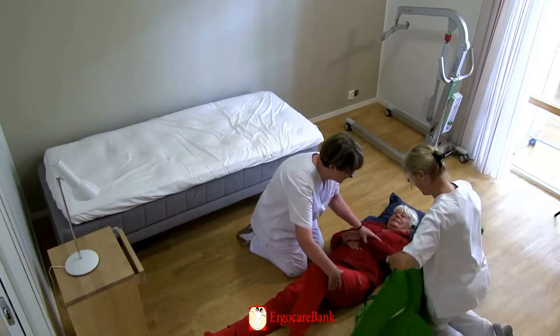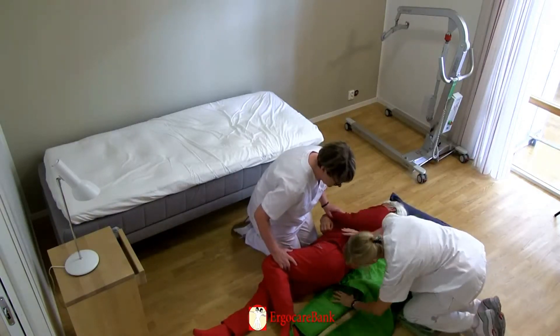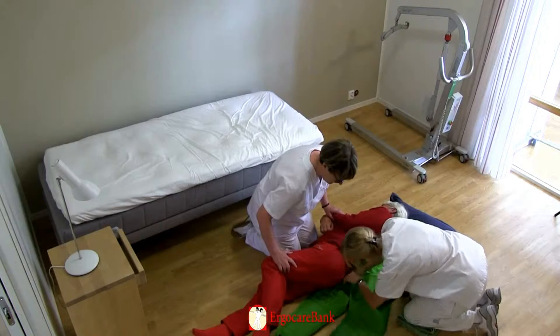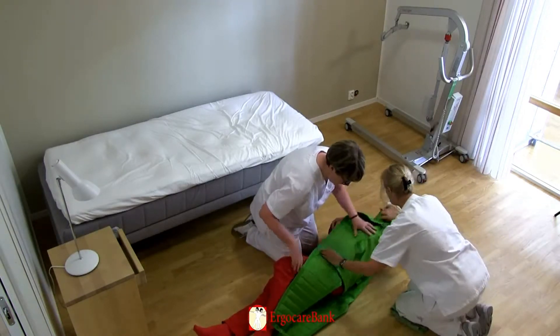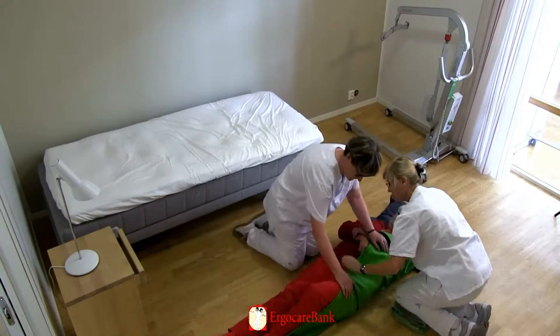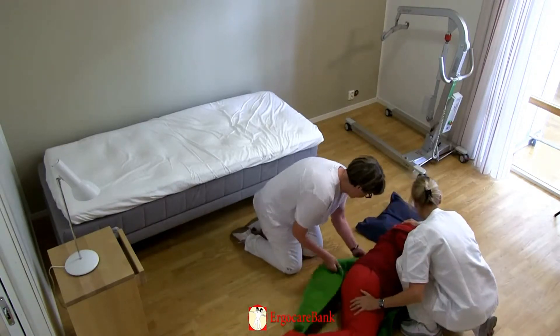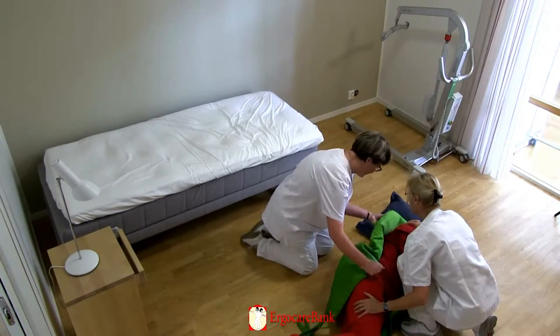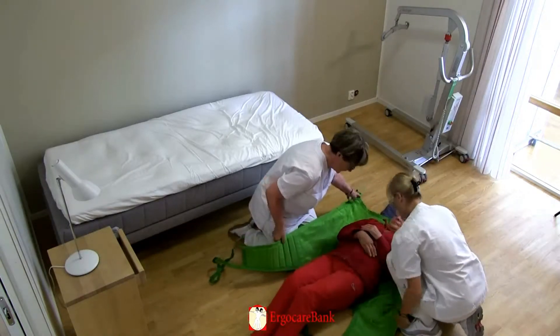We'd like you to turn onto your right side. Bend your left knee, please, and lift your left leg across your right leg, please, and turn your head towards me. The staff position the sling under Celia. The lower end of the sling should be in line with the level of Celia's coccyx, and the middle line of the sling follows the spine.